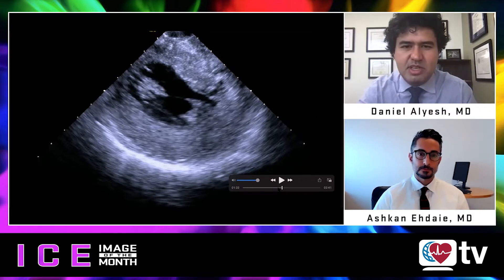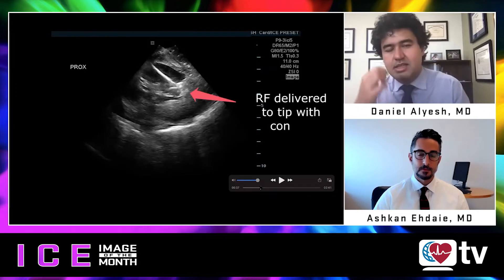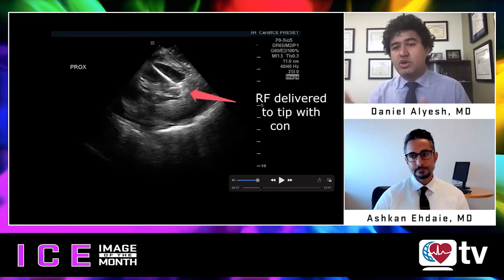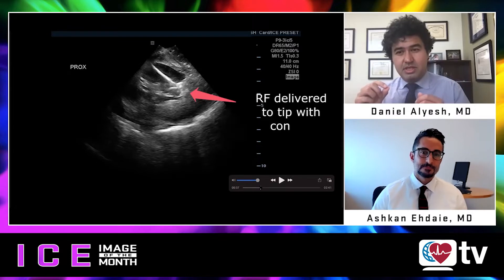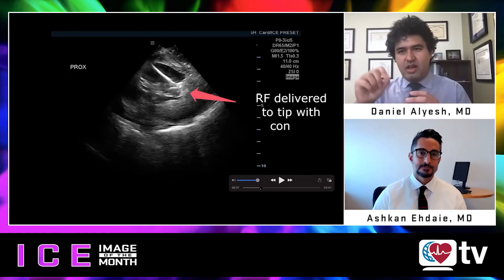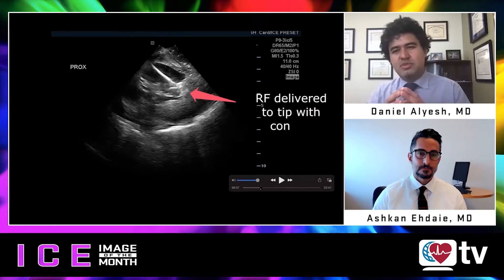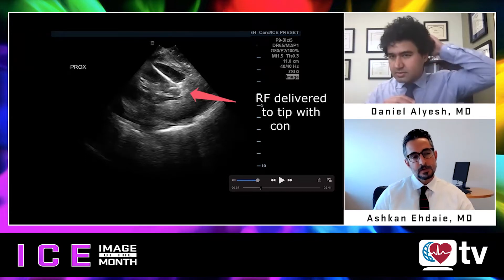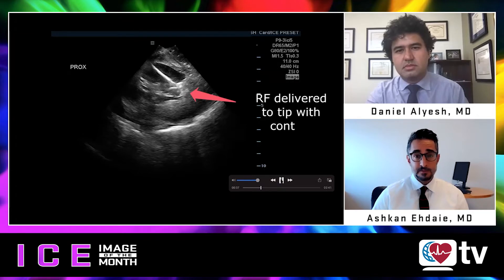Turning to catheter stability — from the retro-aortic approach, PVCs often originate from the tip, and with a contact force catheter you can very easily slide off in either direction. ICE verification of contact is very helpful. What tips do you have for using ICE to improve stability on papillary muscles? It's probably one of the most important issues — you have a dynamic structure, and ectopy itself can throw you off.